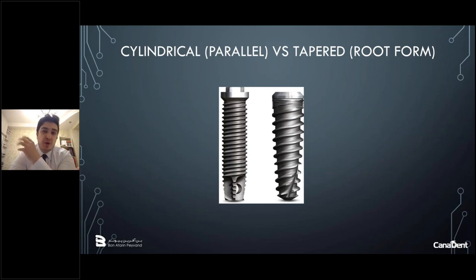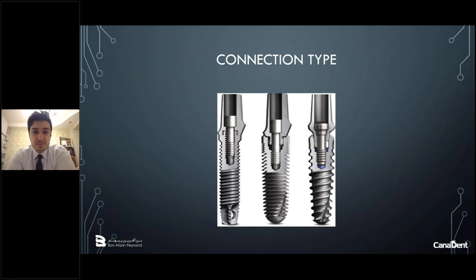Nowadays, most major companies are still continuing the manufacture of parallel-sided implants, but they have added the tapered form to their manufacturing lines too. So they have all the options for you to choose what is in your best interest. But what about the connection type of implants?